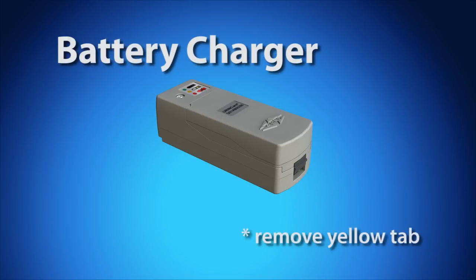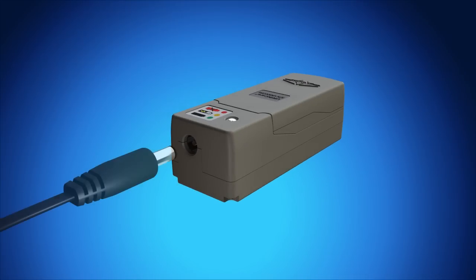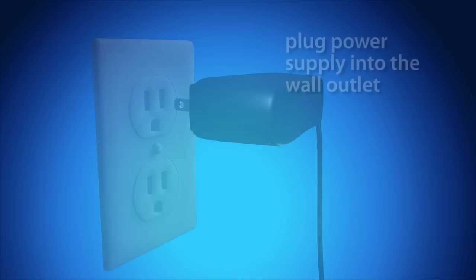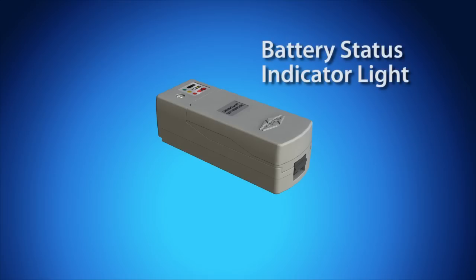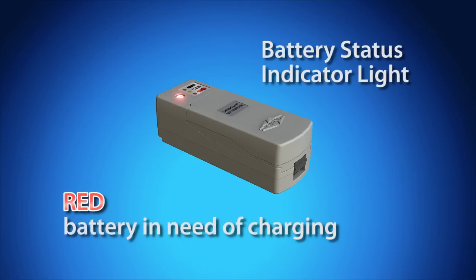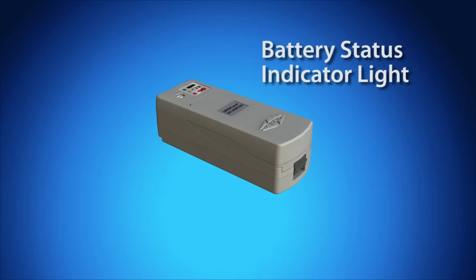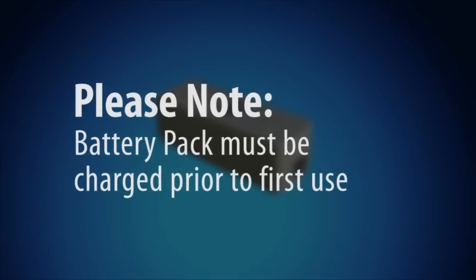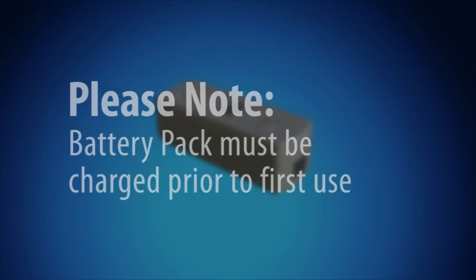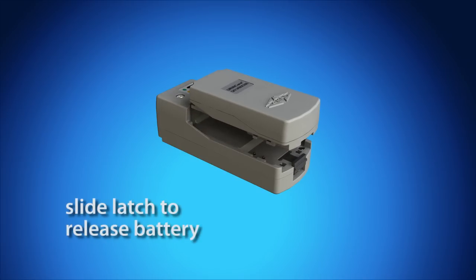The yellow tab on the charger must be removed prior to use. In the upper left corner of the control device kit is a box containing the wall adapter power supply for the battery charger. Connect the cord of the wall adapter power supply to the battery charger unit and plug the adapter into a wall outlet. At the top of the battery charger unit is the battery status indicator light. A flashing red light indicates the battery needs charging. A flashing yellow light indicates the battery is charging. A solid green light indicates the battery is fully charged and ready to use. Please note, the battery pack must be charged prior to first use. To remove the battery, pull down on the release latch and slide and lift the battery away from the charger.